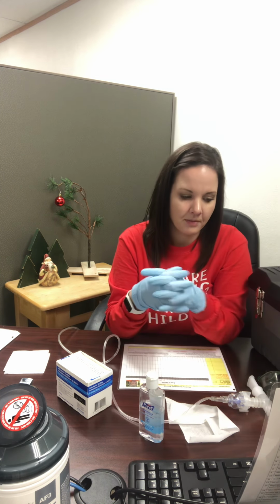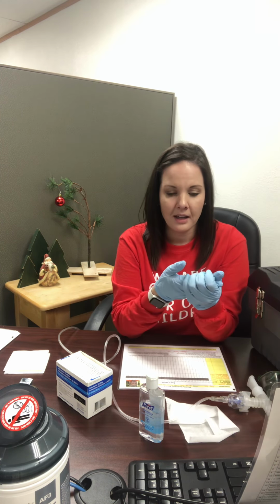through their nose. So one thing that you'll want to be cautious of is that sometimes the nebulizer can trigger coughing or vomiting. So you might want to have tissues or a waste paper can just in case you might have a mess. Have the assistant remain with the child for the duration of their nebulizer treatment. You can remove your gloves. You're going to wash your hands.